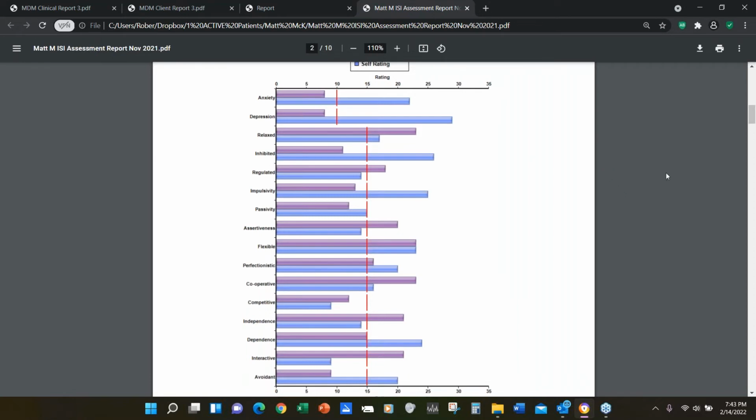I love the ISI. I love the pre-prep that it gives me as well for when I'm going to sit down with somebody, because you know about this person by looking at this. You do, and I have read it out to people, and I've had people on occasion say, "Oh, I'm good with this. I don't need to see the map." In fact, they said, like, well, "You've explained so much to me about what's going on with me. I'm done here. I go back to my counselor." And I'm like, "Oh, well, we're supposed to do neurofeedback, but okay."